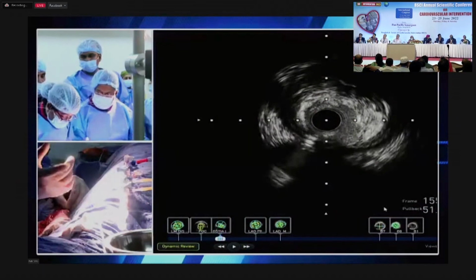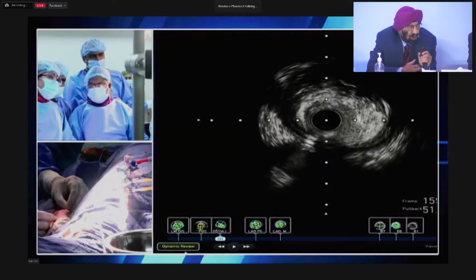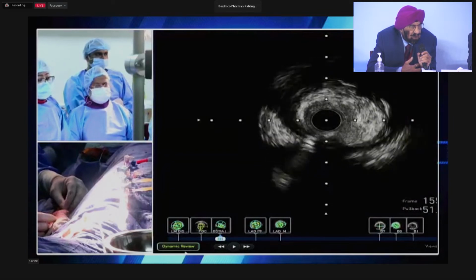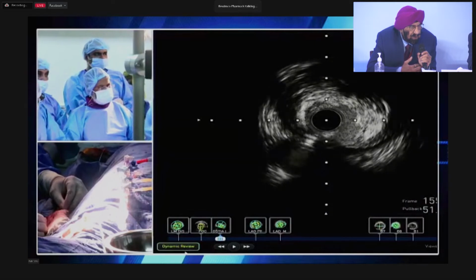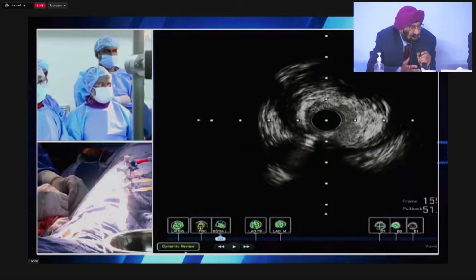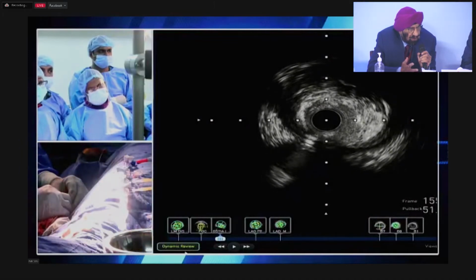Dr. Gambhir, I want to ask you, if you want to stent the LM, do you want to stent up to the LM ostium? If there is no disease at the ostium, as in this case, I generally do not go up to the ostium for two reasons. One is that once you are at the ostium and have to engage the guiding catheter time and again, you may cause a longitudinal distortion of the stent. Number two, if the patient develops disease in the distal circulation at a later stage, then it becomes difficult to engage the guiding catheter. So I'm not the one who would go up to the ostium of the left main. I'd leave a few millimeters. And as you said, 8 millimeters of the length of the left main from the bifurcation needs to be stented. That's, I think, fair enough.